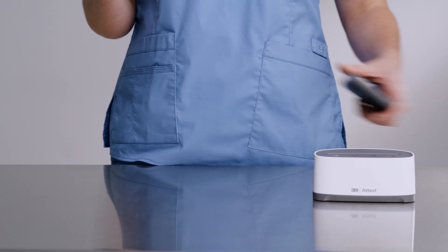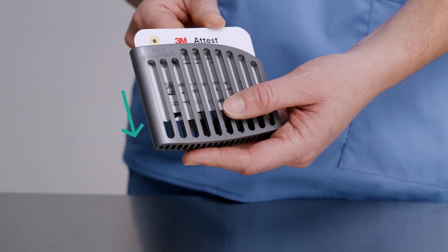Slide the eBowieDIC test card into the cardholder with the arrows pointing down until the card is fully seated in the holder. Ensure the label side of the test card is facing the side of the holder with the 3M logo.